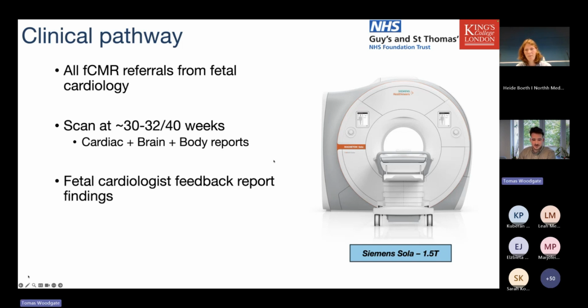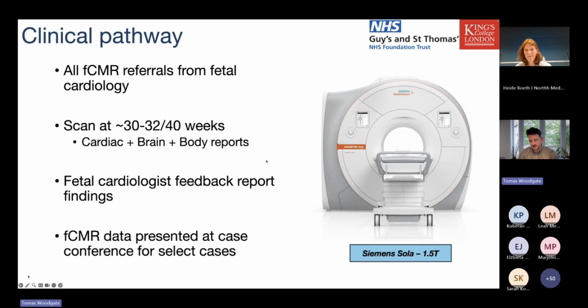The fetal cardiologist will feed back the results of the report findings to the patients, and will often have a later ultrasound scan after the report is back. And in some cases, fetal cardiac MRI data may be presented at case conferences or other meetings relevant to patient care.